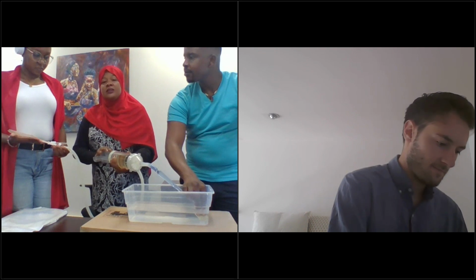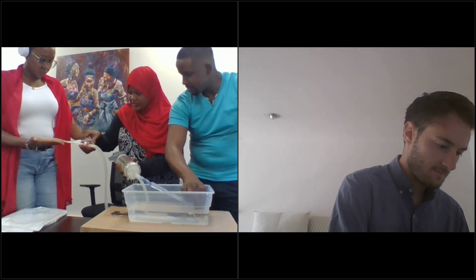What I want to do is push this blood back to the bag. So I will tell the anesthesiologist that I'm ready to push this blood to the bag. Please open to the bag and close to the air. And as I'm pushing, she will be rocking the bag. Maybe we can see yours so that somebody can see how the blood is coming in.